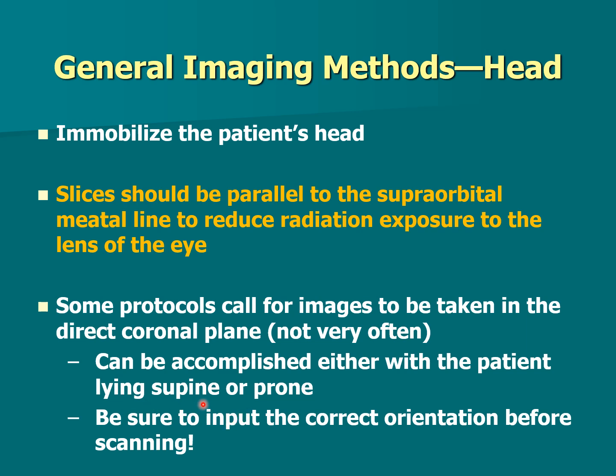If you're doing it either supine or prone, or change the angle, or change how the patient is lying or entering the tube, the gantry, be sure to input the correct orientation before scanning, whether they're supine or if they're going in head first. All those things still matter.